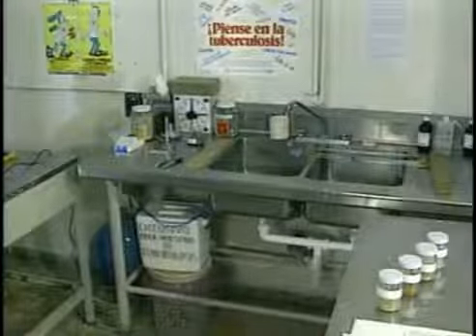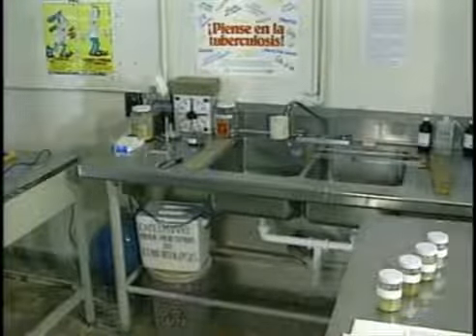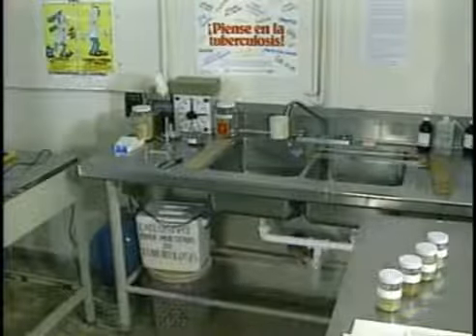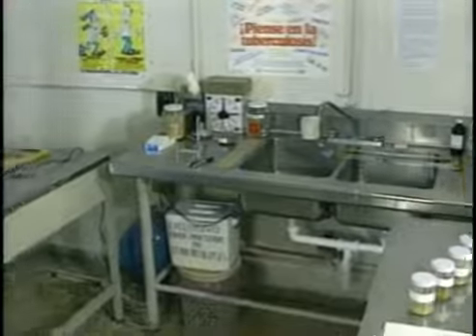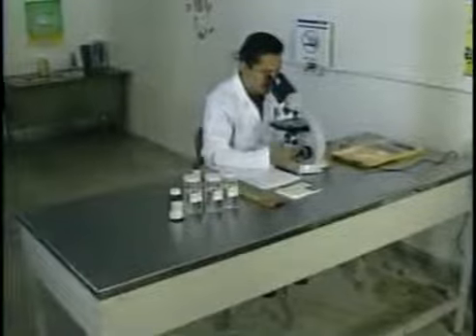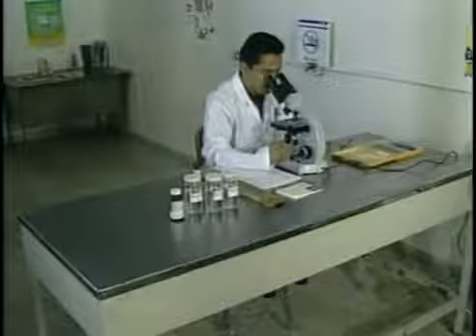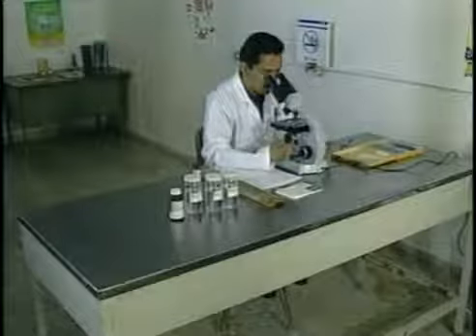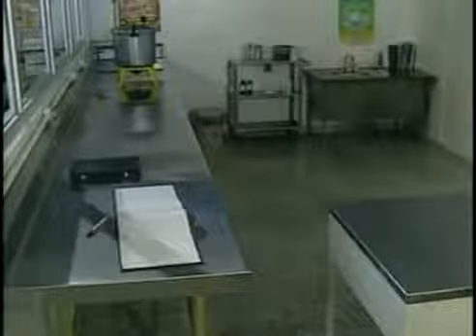To perform TB microscopy, a laboratory must have 3 areas: a well-lighted space with a sink or basin with running water for preparation and staining of smears, a microscope table. If there is no electricity, this table should be placed directly in front of a window, and a table for recording results and slide storage.